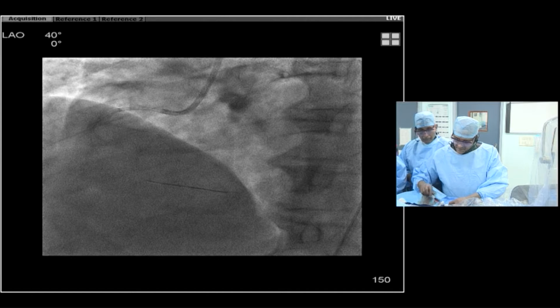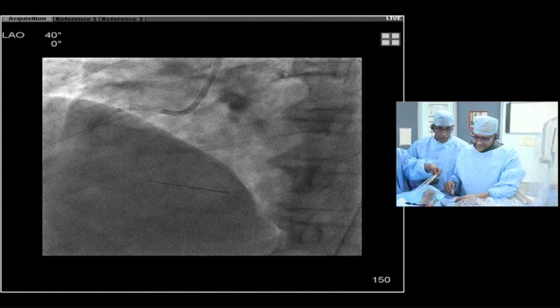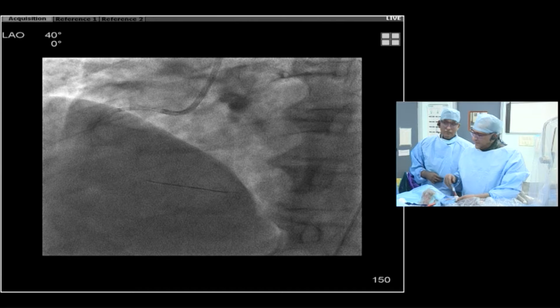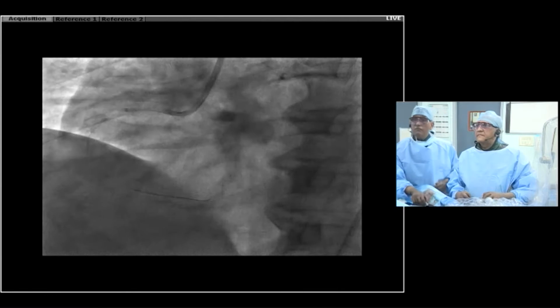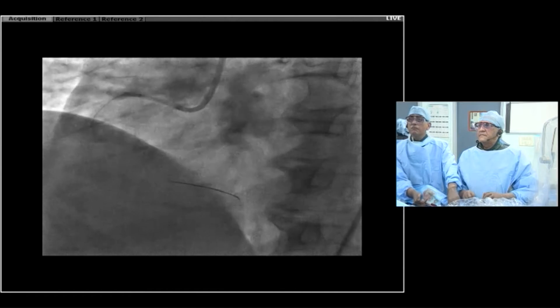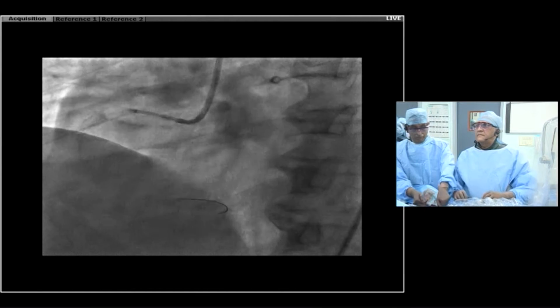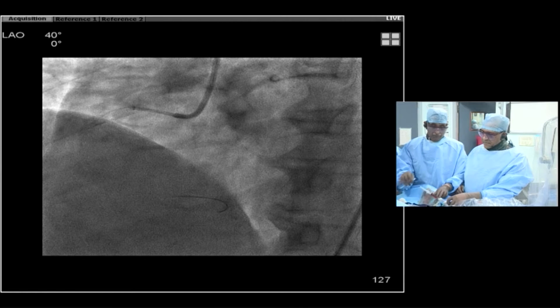Could you make some comment regarding calcified lesions? Sometimes in a CTO case, you cross with, let's say, a Fielder or sometimes a Gaia, and no balloon crossing is possible. No microcatheter can cross, no smallest balloon can cross.